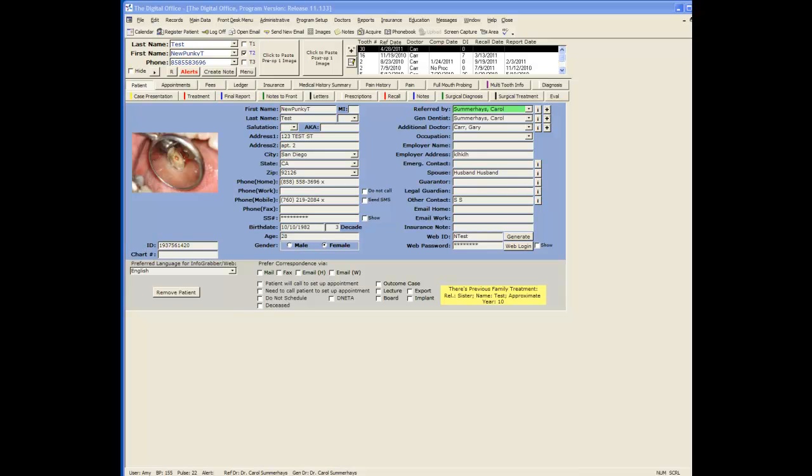Creating a CBCT report using TDO is very fast and efficient. To get started, go to your patient that has the CBCT image that you wish to do a report on.